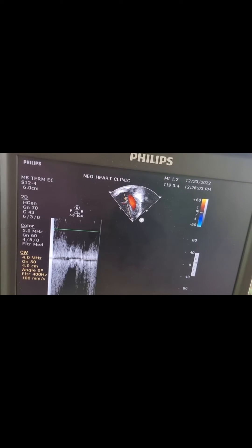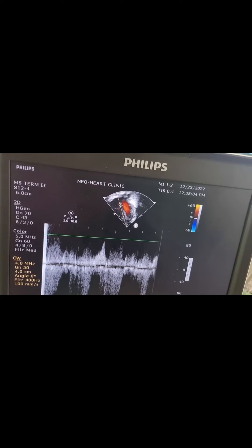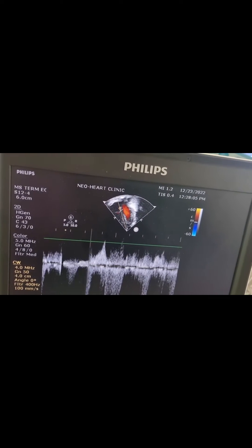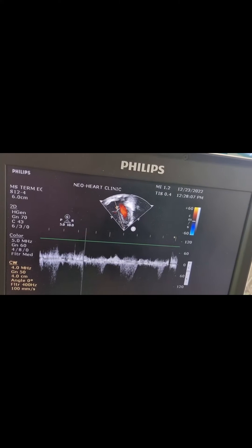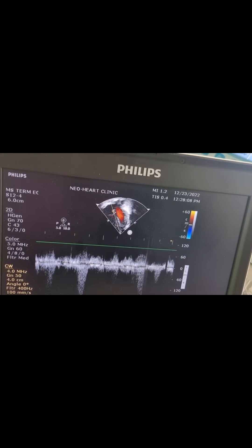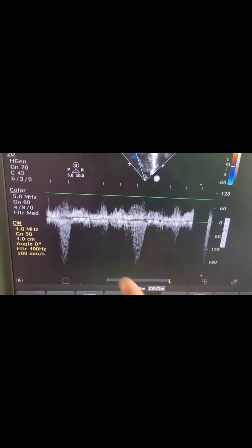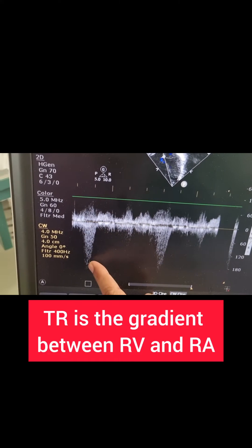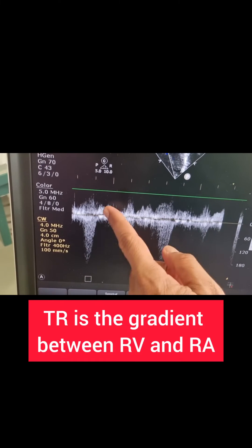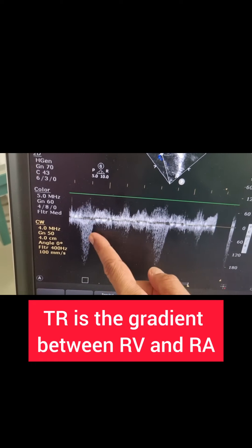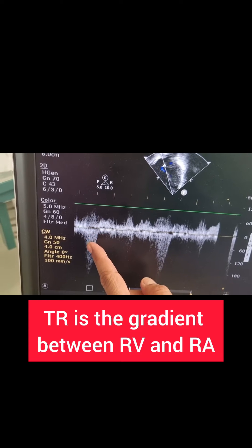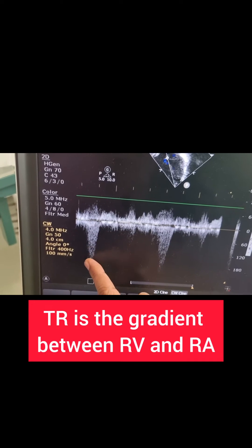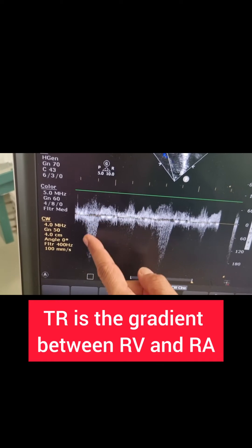Do it with the continuous wave Doppler. And because the jet is blue, the Doppler signal will be below the baseline. This Doppler of the TR jet with the continuous wave Doppler will be recorded like this.